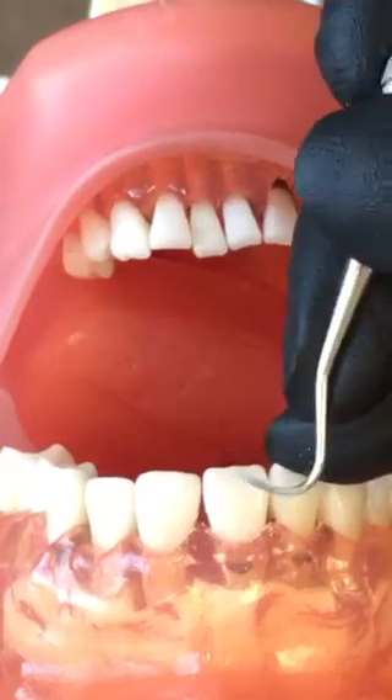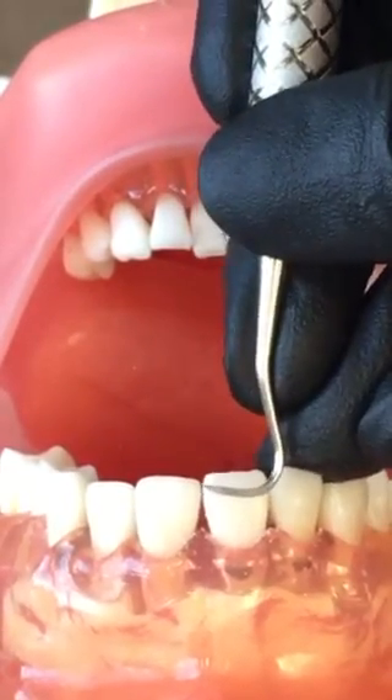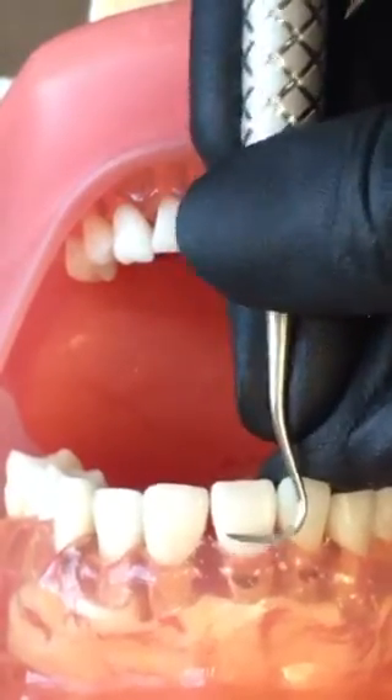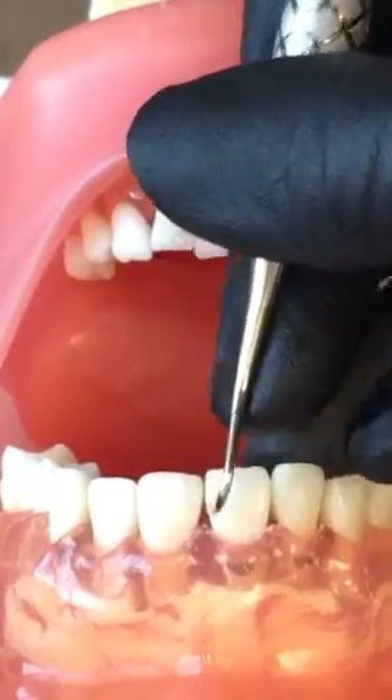You're still going to divide your tooth in half, starting midline. I've got my fulcrum with my palm up. Engage my blade. And roll interproximal.